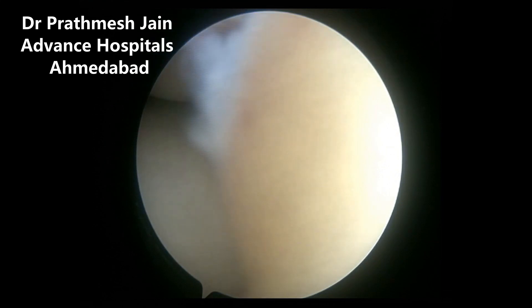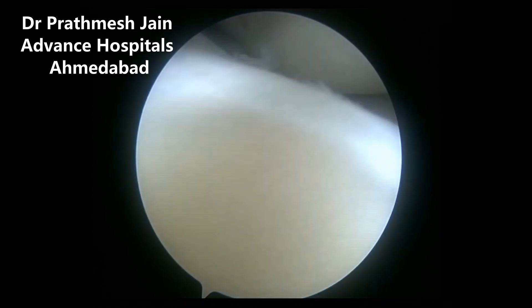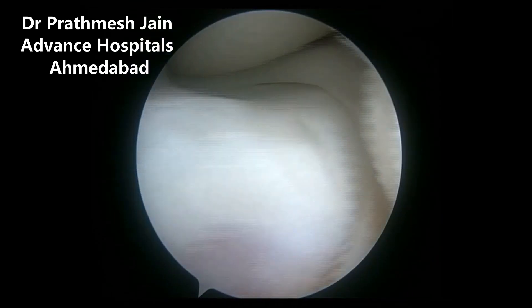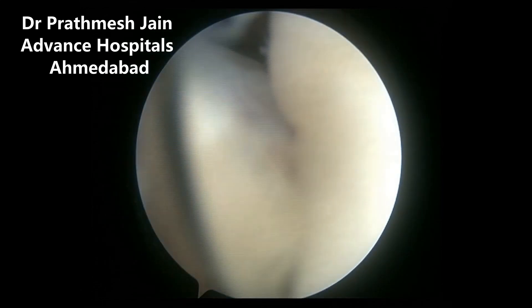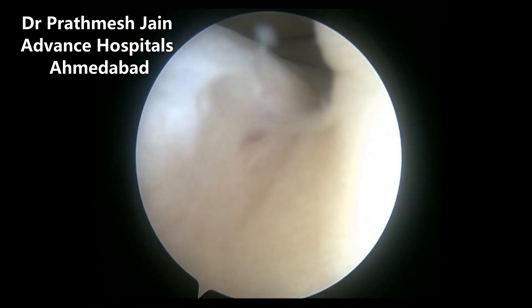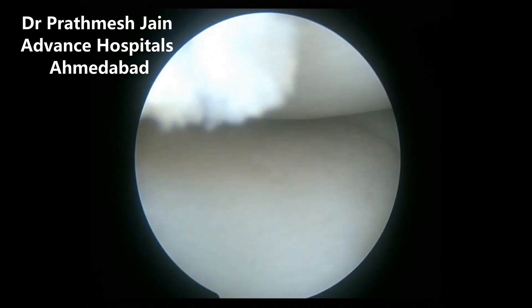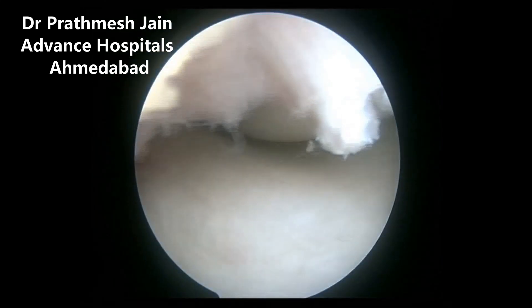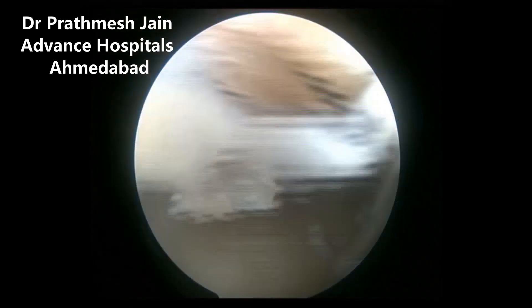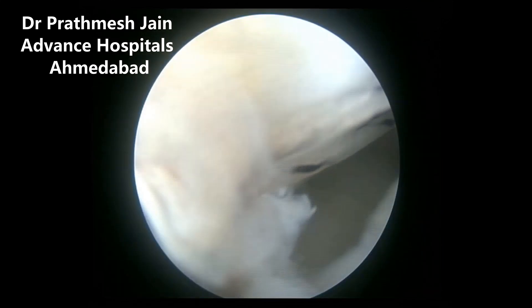We save drilling through the femur, and the graft is now passed into the joint. After that, we will use a spinal needle to make a portal just beneath the intermeniscal ligament. We go just beneath it and use an artery forceps to pass just beneath the intermeniscal ligament on the anterior aspect of the knee, thereby avoiding drilling any tunnel on the tibia itself.